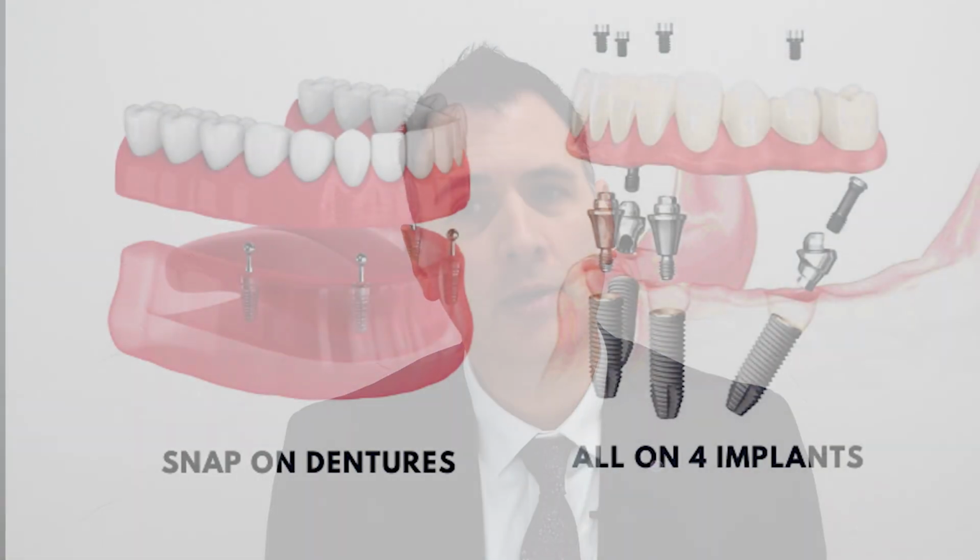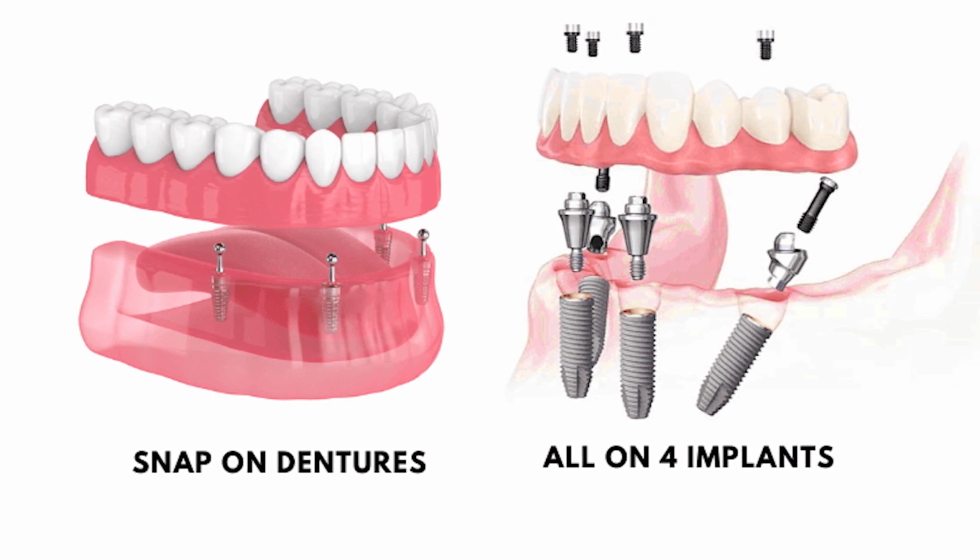The snaps help hold it in place, but they don't support all of the bite force. So in moving from a denture to a snap-on denture, the overall bite force doesn't significantly improve. You might go from a 25 to 30% bite force to maybe a 30 to 35% bite force, which isn't a tremendous improvement, especially given the cost of getting that snap-on with the placement of the implants. That's why we've developed other options that provide significantly higher bite force than the 25 to 35% of the options we've talked about today.